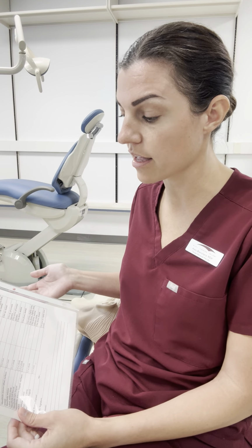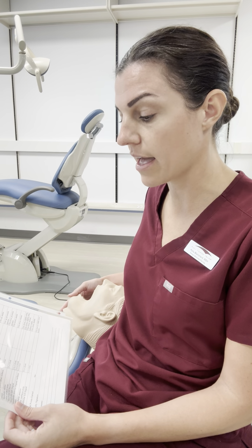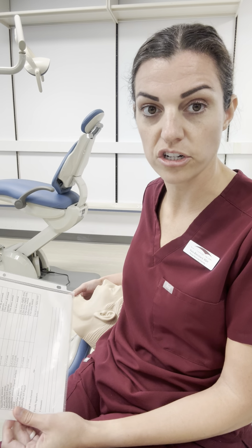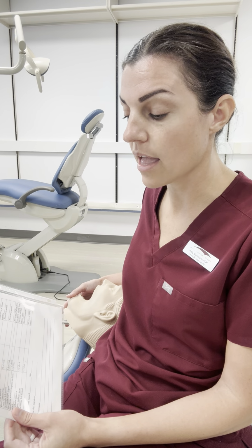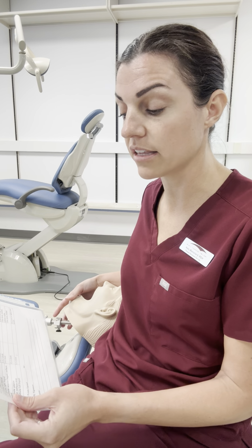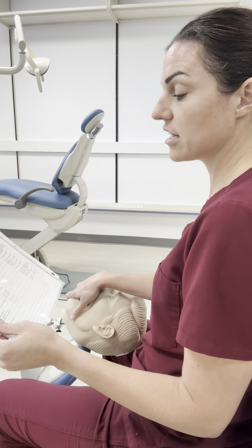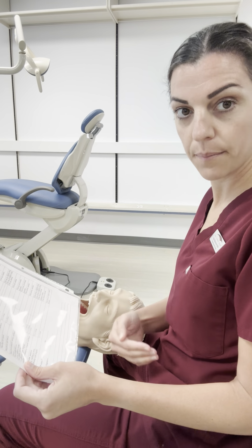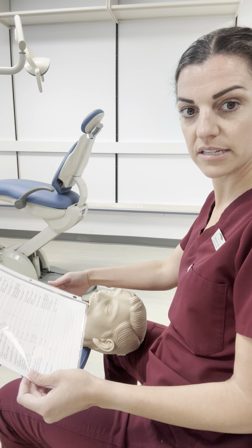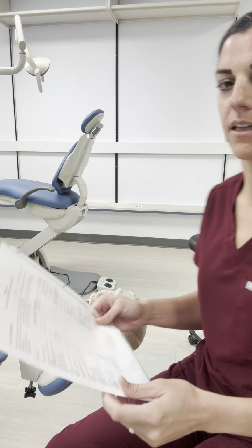If you're at 12 o'clock, you're sitting at 12 o'clock, you have the patient's head positioned the right way, and you're going to say that. For example, if I'm an instructor and it's checkoff day and I say, maxillary left lingual, I need to know that for a left-handed clinician, you're going to be in that 1 to 2 o'clock position. The patient's chin is going to be up and towards the operator. So I want you to get in the right position, tell me where you are, get the patient in the right position, and tell me what that is. All right, thank you.